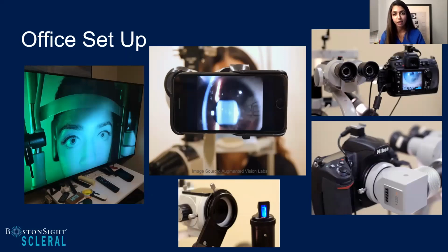We have a Nikon camera that's attached to a slit lamp. So I love working at this location because I get beautiful photos that I oftentimes get lost in looking at, because you can capture so much with these photos.